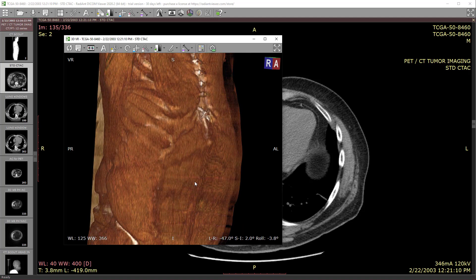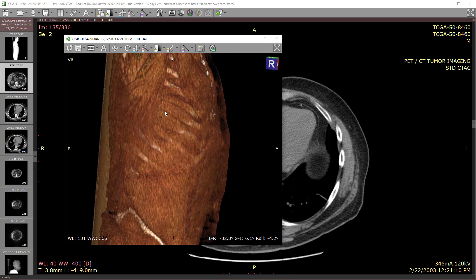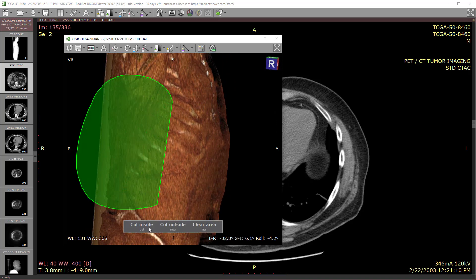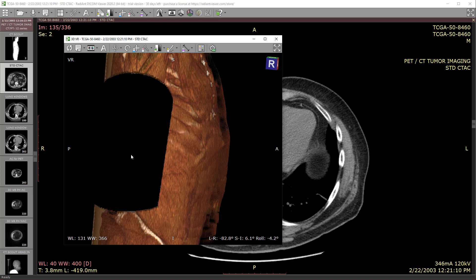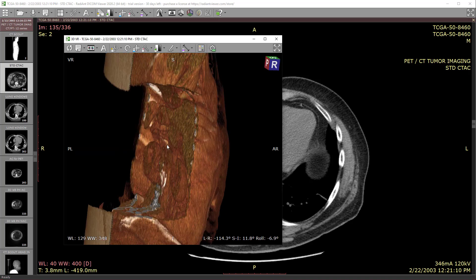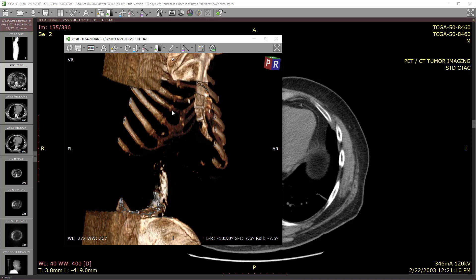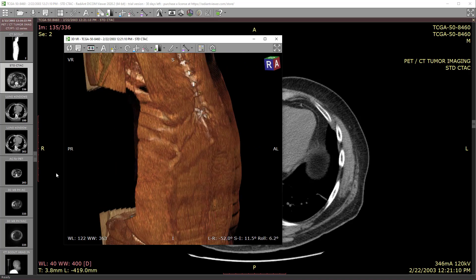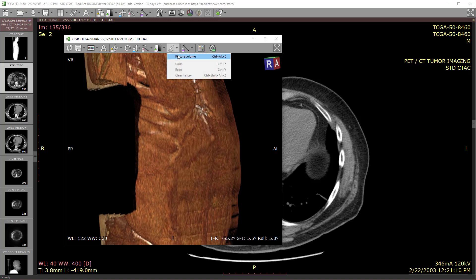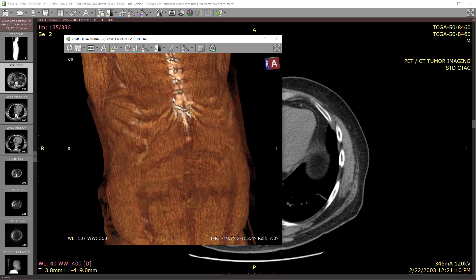You can also go in here and measure — just click and put little measurements in to see how big things are. There's also a scalpel tool to slice away areas. You can cut into a region, and then as you rotate around and middle-mouse drag you'll see a cross-section from where you made your scalpel cut. Hit restore volume to get back to where you started.